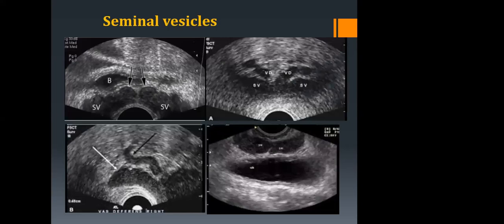As we exit from the prostate, we have accessory organs. We have the seminal vesicles. We can't avoid these because they are part of the system. Very many have described them as a mustache. The men who have beards know what a mustache is. Ladies, the mustache is to the upper lip, just below the nose, and only restricted to that area, while the rest below the lips and the rest of the cheeks is devoid of the beard.